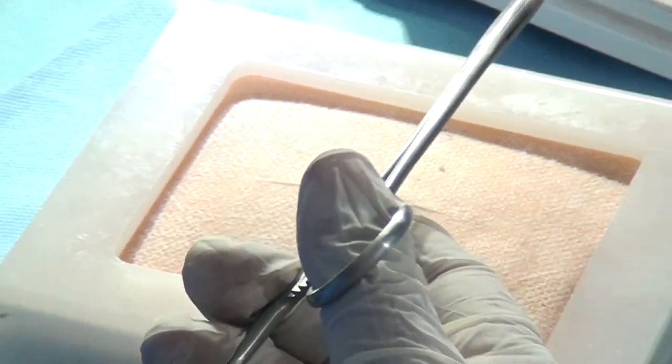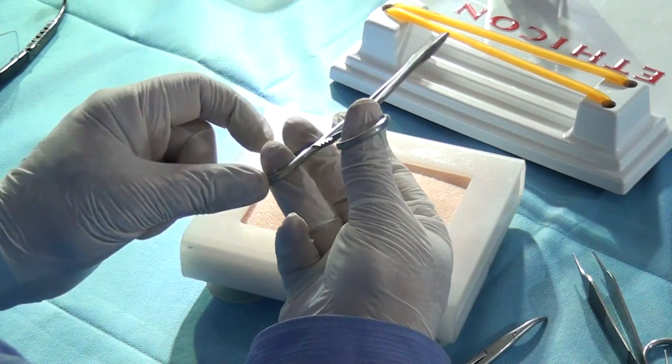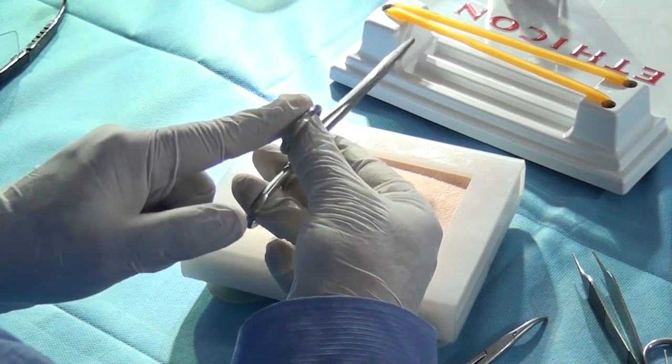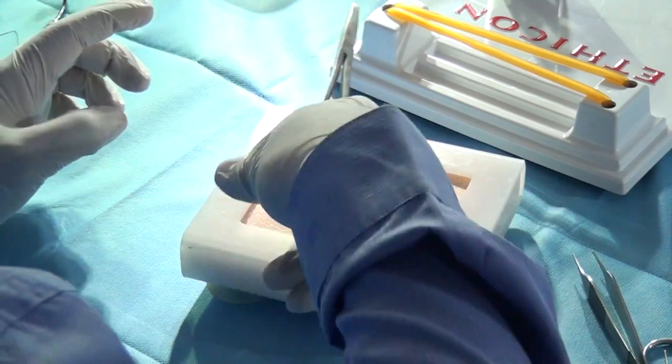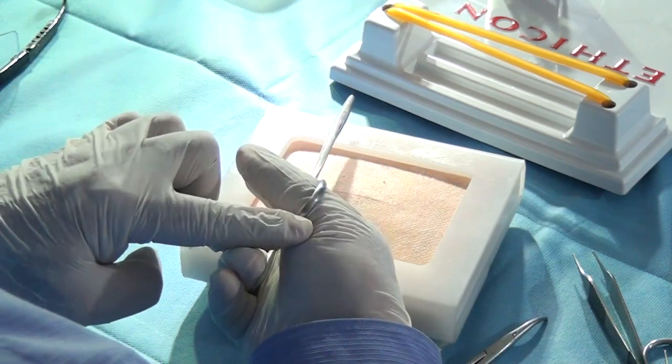And how do you hold a needle holder? Go back please. There are two grips again. Conventional grip, which is this. I told you in the mosquito and other artery forceps, you should be just about distal to the terminal interphalangeal joint of the thumb and the ring finger. If you go in here, you become one with the instrument. Now you'll have to move with the instrument, so instrument controls you.